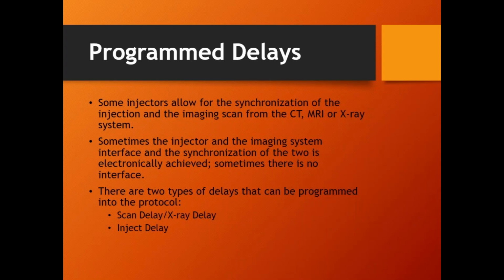Now, the reason they program delays like that, there's 2 buttons. Remember, there's an X-ray exposure switch or a start MRI switch. I've never seen one of those. What's the start button on MRI look like? Does it say start? I don't know. There's a start imaging button. There's a button. And then my injector also has a start button, basically. All right. So it's easiest on the operators.